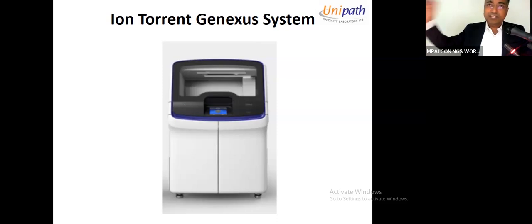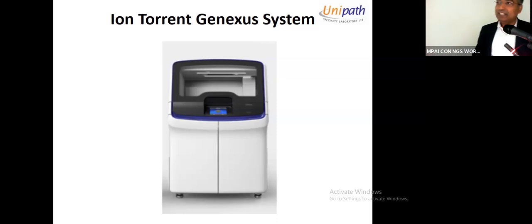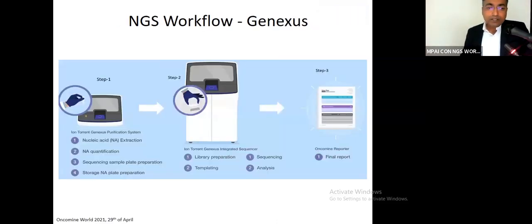Of course, there are challenges. It is not that anything comes without challenges. There are some limitations and challenges, but this is the area where this field is moving. Full automation is being considered in these areas, and successfully so. When I was talking just about the sequencer, even the extraction part, I'm told that there is a system available where it can be fully automated. Even extraction is automated, and then it is linked to the system.